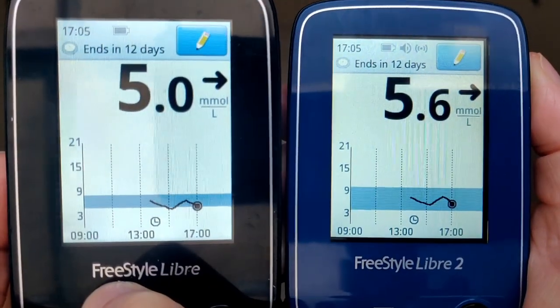Later on, doing another check: Libre 1 says 5.0, and Libre 2 says 5.6. Really good and very similar. The two graphs show the same direction. So overall, which do I think is better? It's really hard. There were differences in accuracy, but sometimes the Freestyle Libre 2 was more accurate and sometimes the Freestyle Libre 1 was. Neither was consistently more accurate. The Libre 1 has the advantage of readings on both reader and phone; the Libre 2 has the alarms.